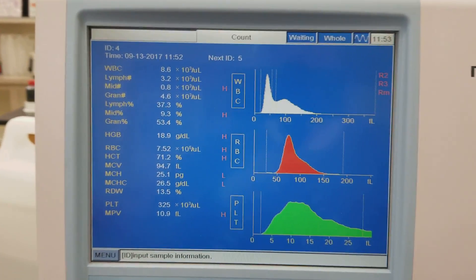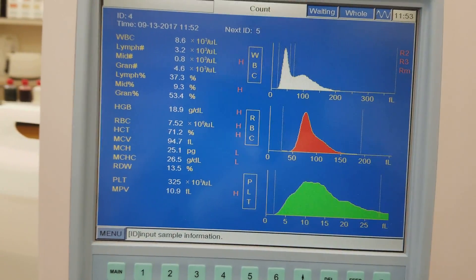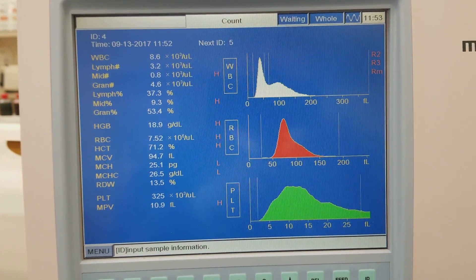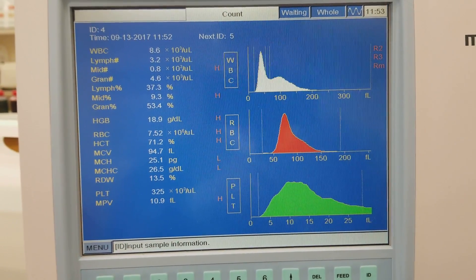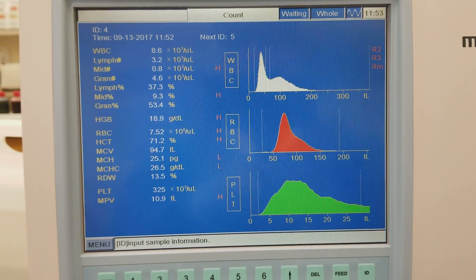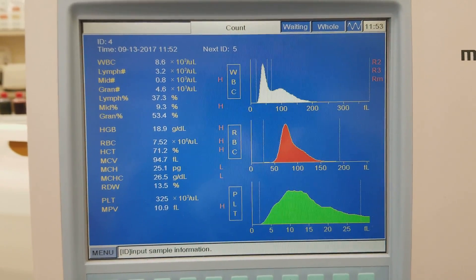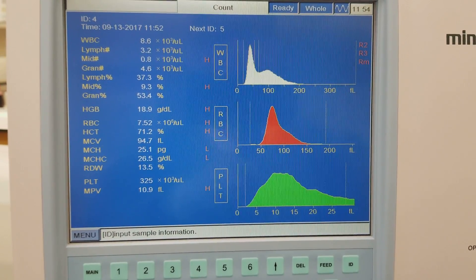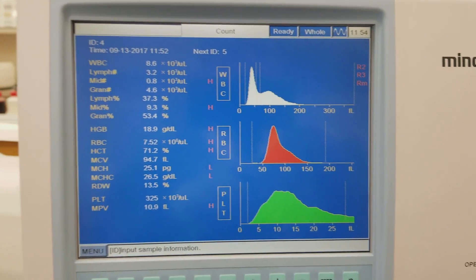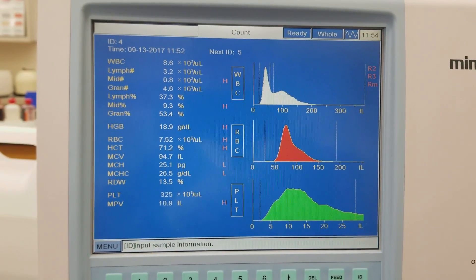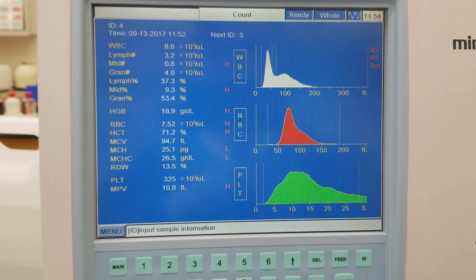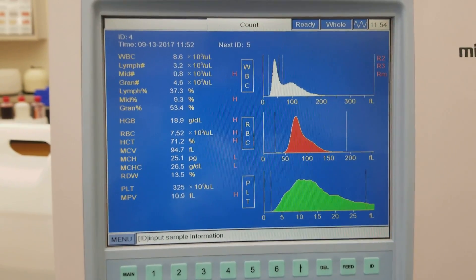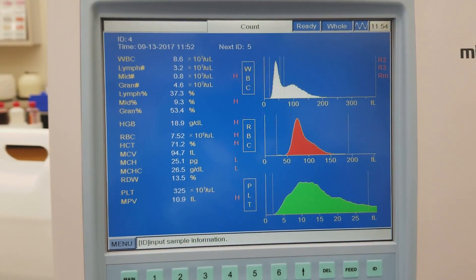I ran another normal specimen, which is basically like your QC right now, and it's still going a little higher than expected. What I'm going to do is run the easy clean cleanser. What you would want to do after maintenance of a critical part of an analyzer is to calibrate your analyzer and also run QC.